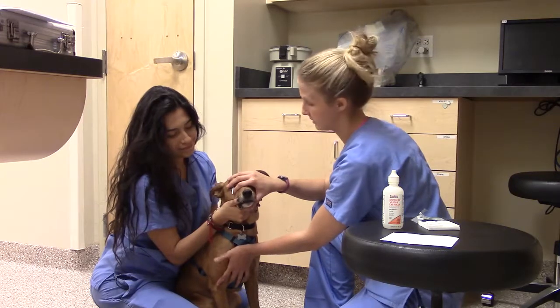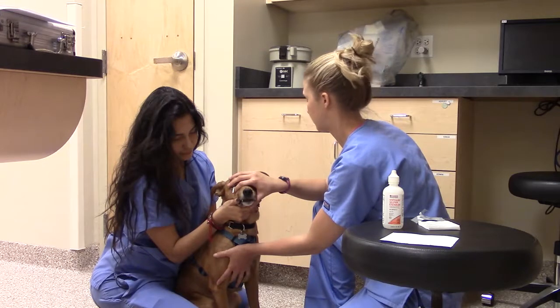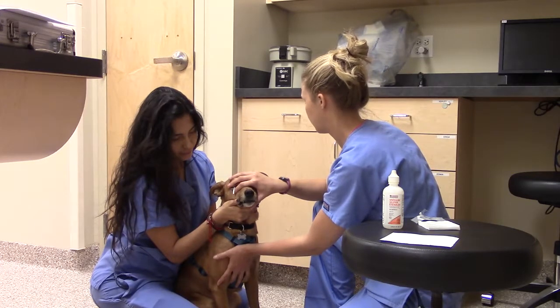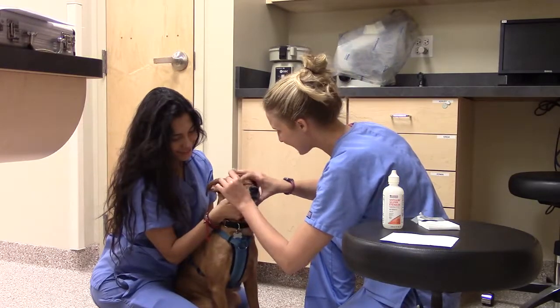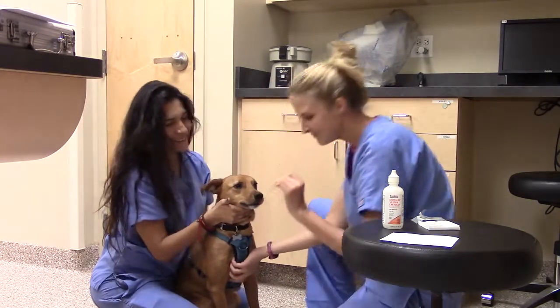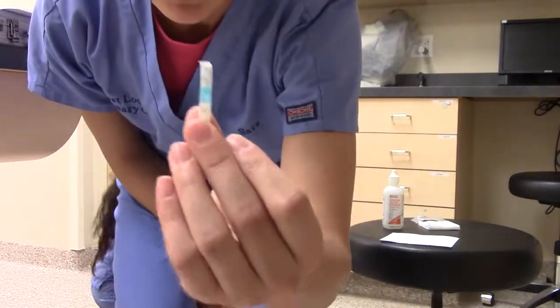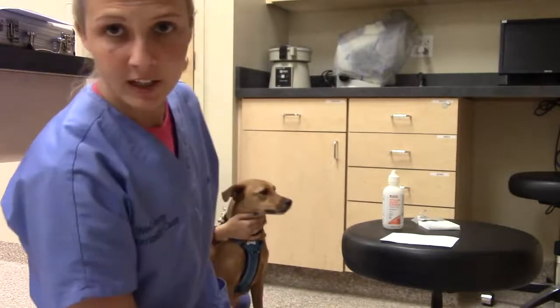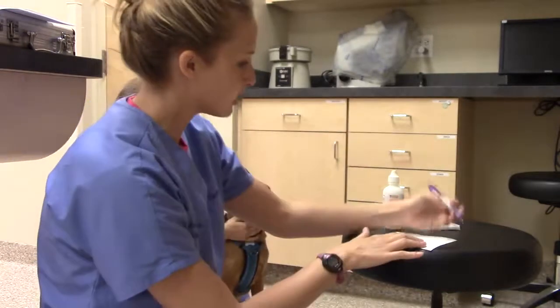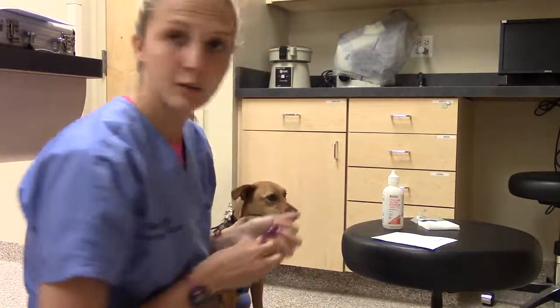10 more seconds. There's some discharge — I believe it's just normal discharge. We did it. Our reading was 21, which is normal. We'll go ahead and dispose of that, and I'm just going to write a note on here that that was the right eye — O.D. — and that was a 21. So now we'll go ahead and do the other one.